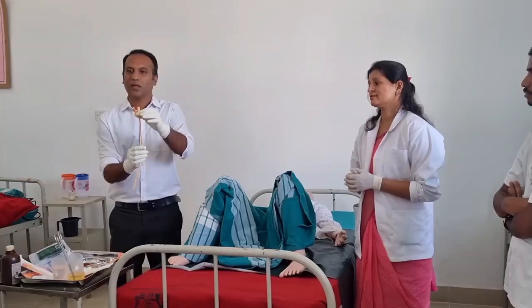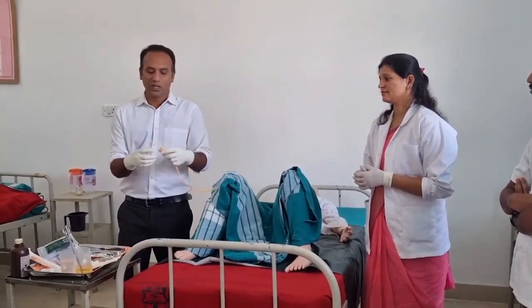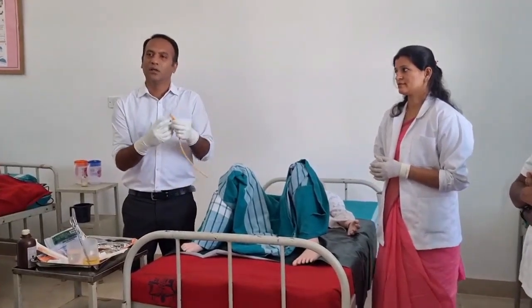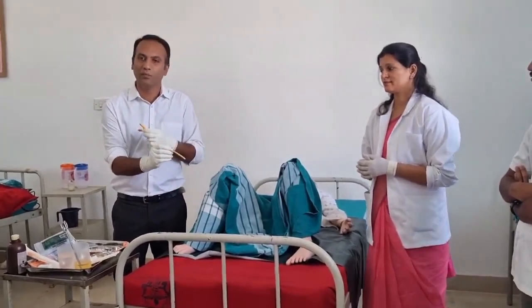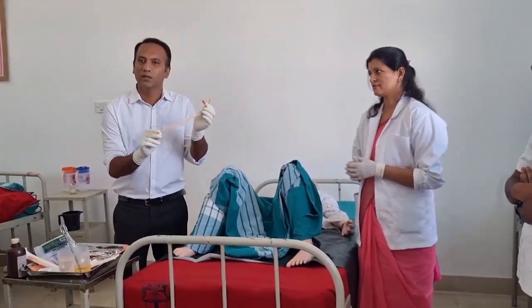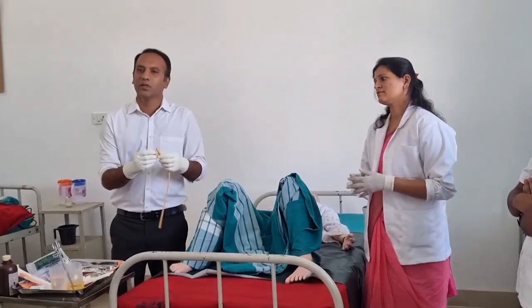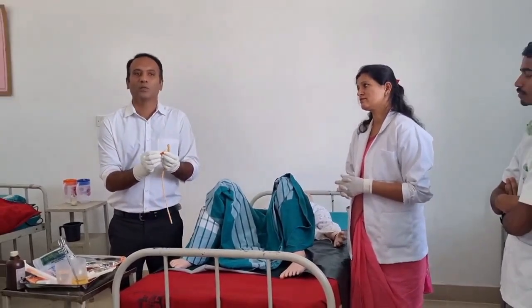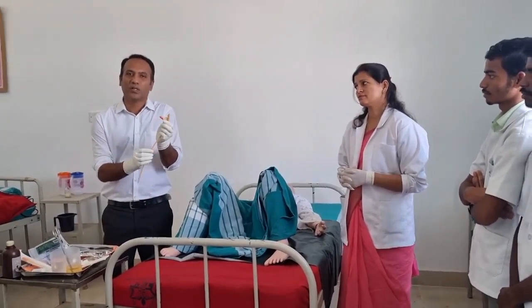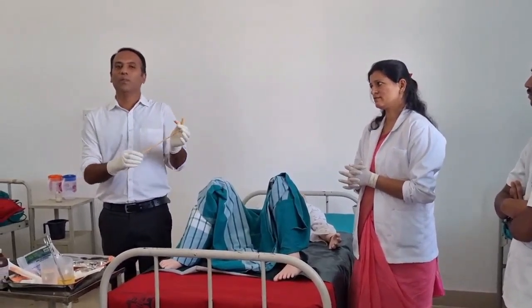So this is one unsterile one. At the end of this video, I will show you how the balloon is inflated. Here they have given 5 ml, which means you generally push 5 ml of sterile water to inflate the balloon. But we still use 10 ml for more secure placement of this catheter. There are other catheters in which it is written 30 ml. That is used in some males where the catheter may slide down up to the prostatic fossa. That is a different condition; we will explain it when we demonstrate male catheterization.